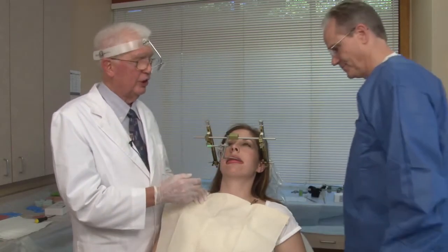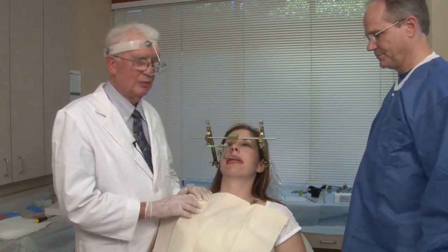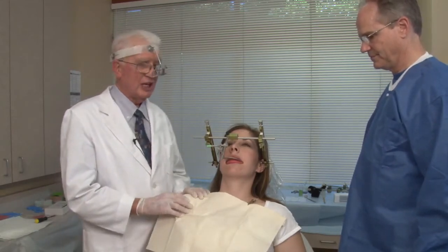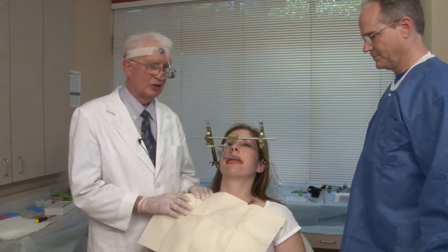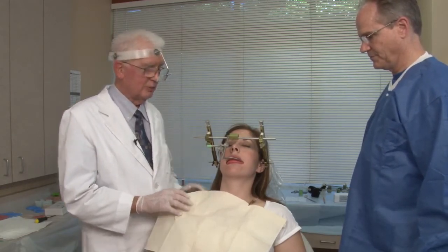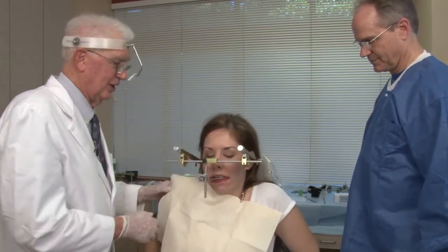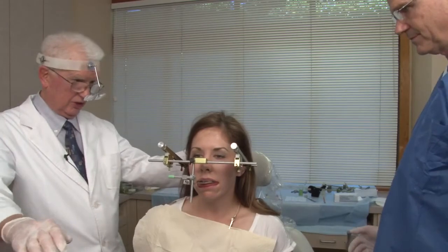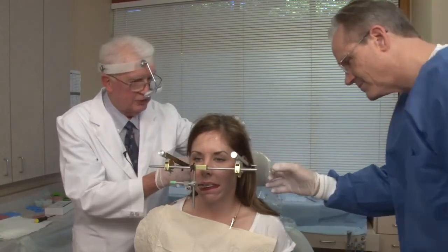And now we're going to actually put the stylus pens on the hinge axis marks that we put on the patient's cheek. And so we have to reestablish the same position that we did when we put the marks on the patient's skin. That is, the patient has to move back in the chair. So sit up, move back in the chair as much as you can. Just rest the arms straight on the side. Look straight ahead, just drop your chin down. And I'm going to stabilize the head in this position.